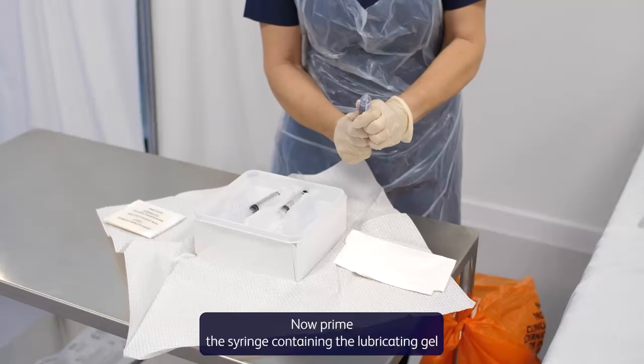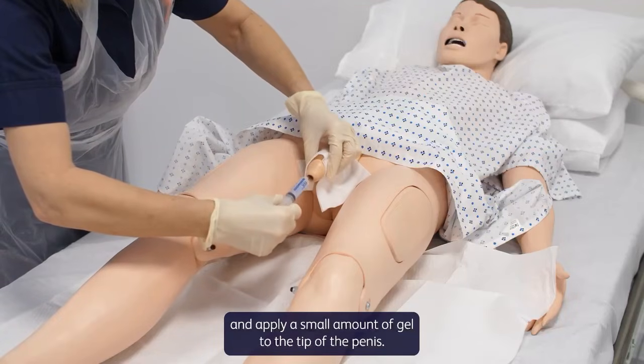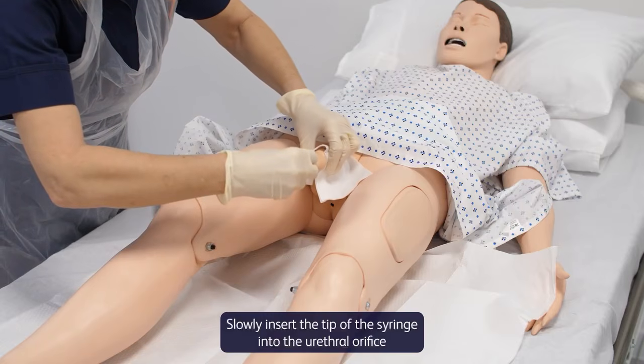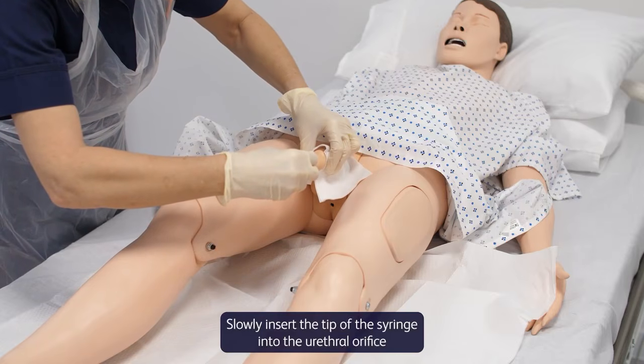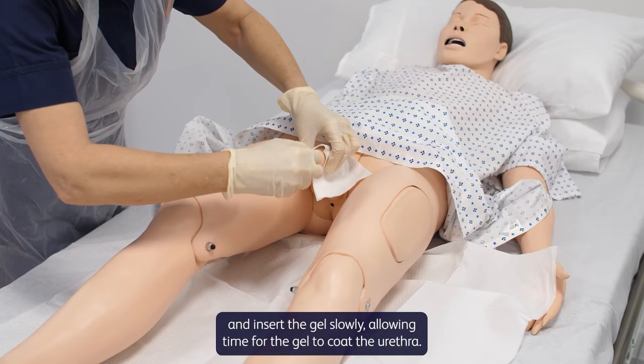Now prime the syringe containing the lubricating gel and apply a small amount of gel to the tip of the penis. Slowly insert the tip of the syringe into the urethral orifice and insert the gel slowly, allowing time for the gel to coat the urethra.